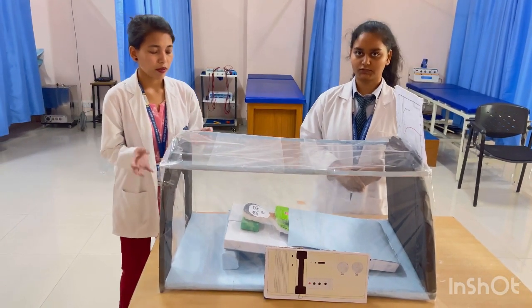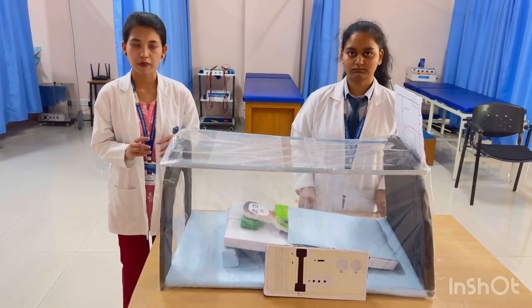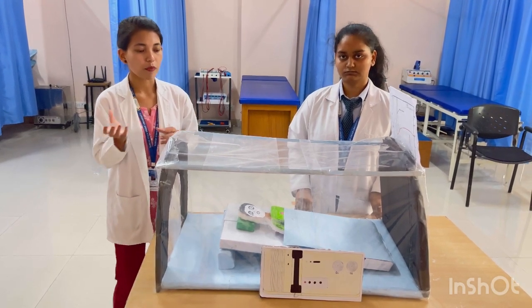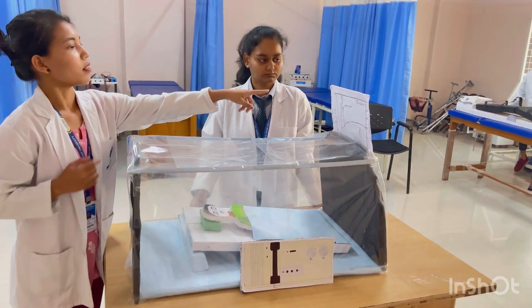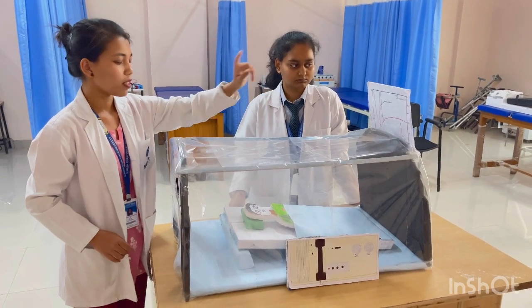And before the patient enters the chamber, we have to check the vital signs, blood pressure, and sugar level. And after monitoring, you have to turn on the switch here, and the machine will display values here, like hemoglobin and hyperbaric oxygen level.